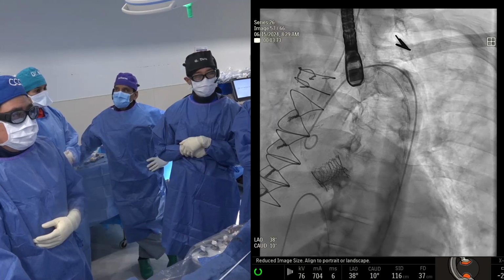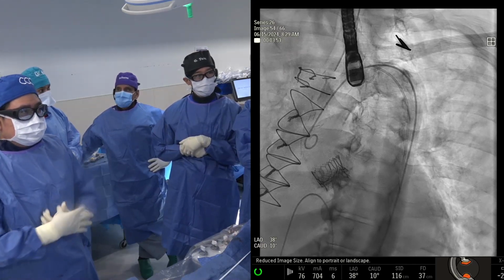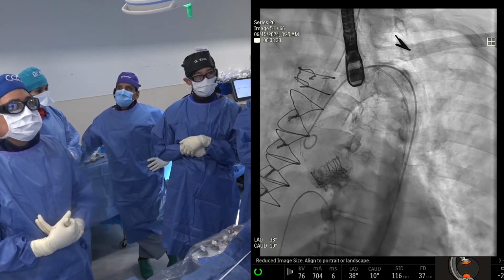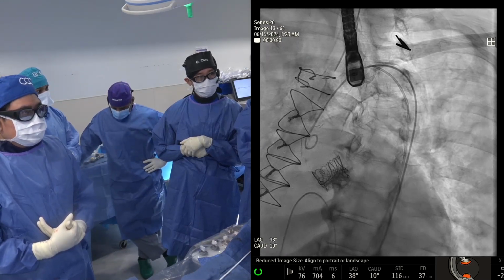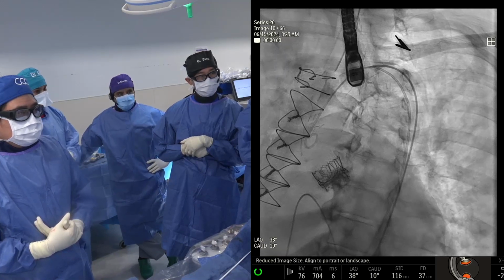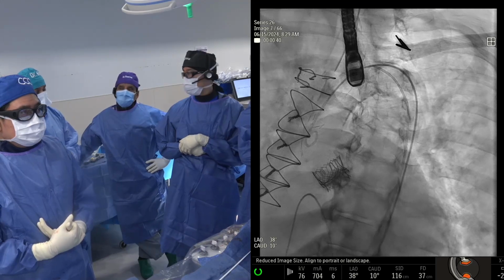And finally, many valves are modifiable. You don't need to fracture it. For example, your second balloon dilatation could have modified the valve to give you zero gradient. You don't necessarily need to fracture valves; you need to modify valves far more than you fracture. I want to convey direct messaging, as I don't think we have a verdict on pre-fracture versus post-fracture.